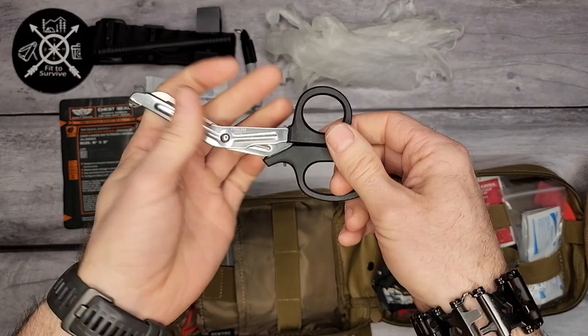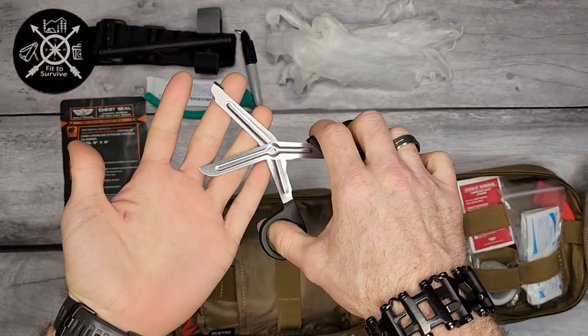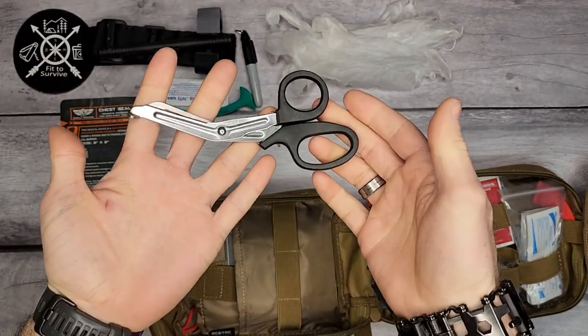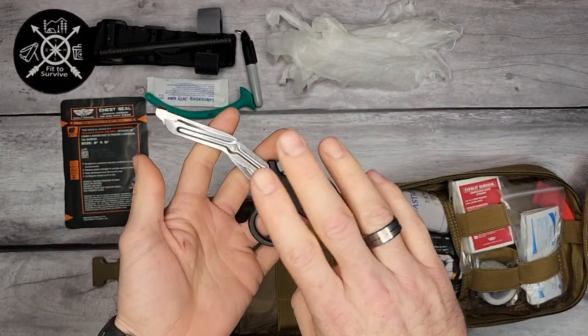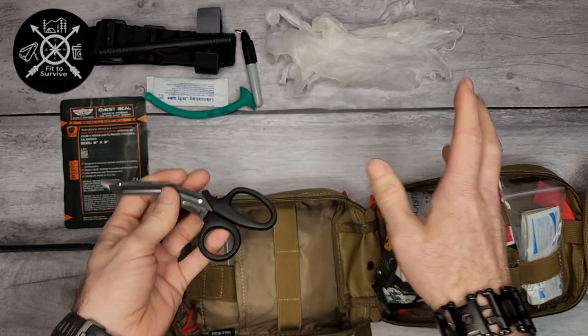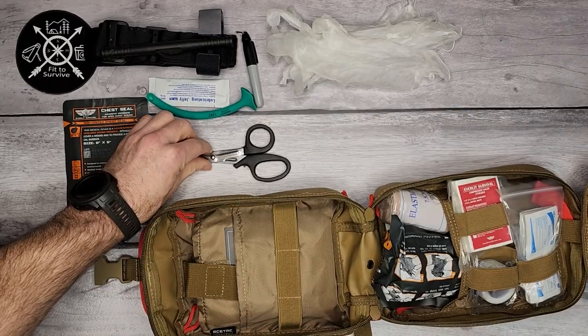It also comes with some shears. These are important for cutting up jeans or clothing because you need to be able to get to the wound to treat it — it's easier to cut off clothes than to try to remove or pull them off.